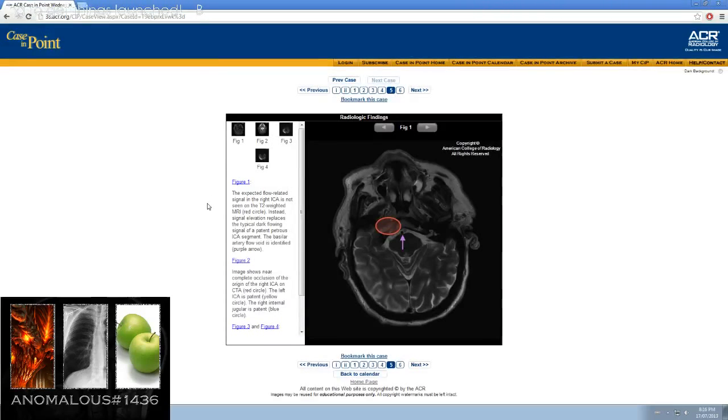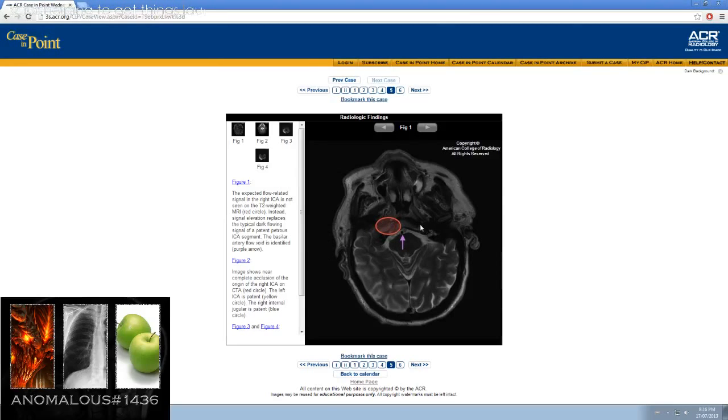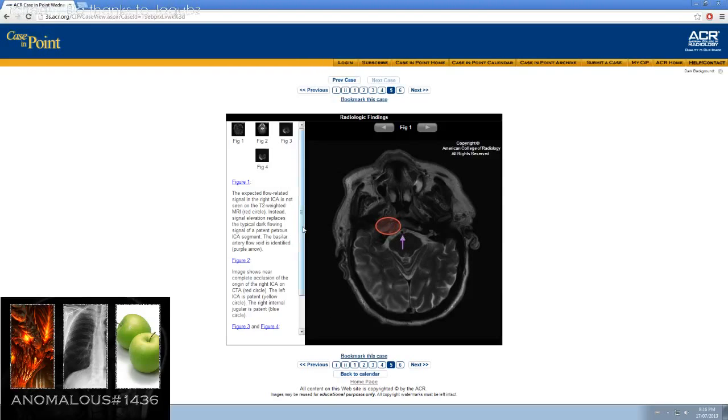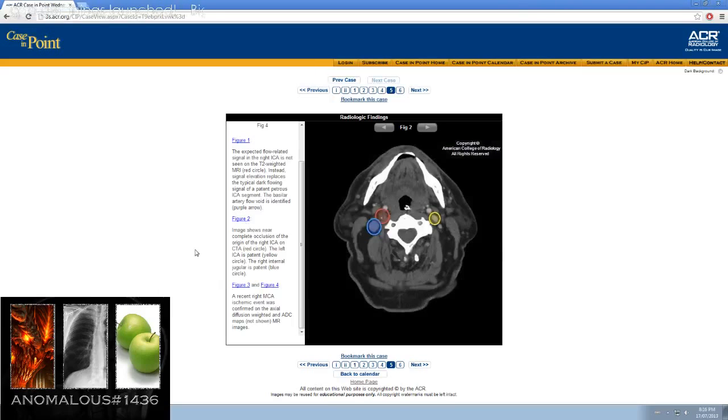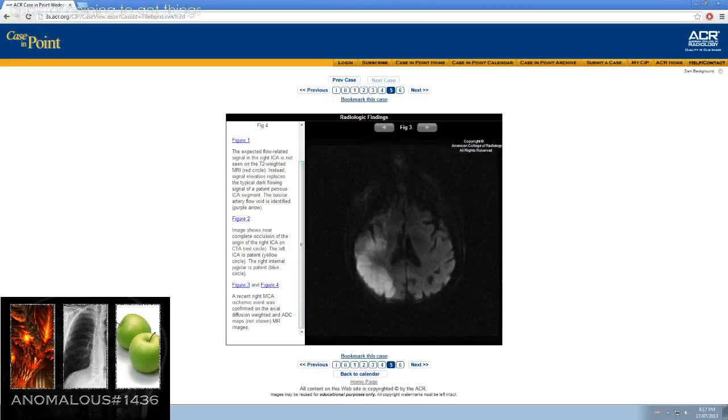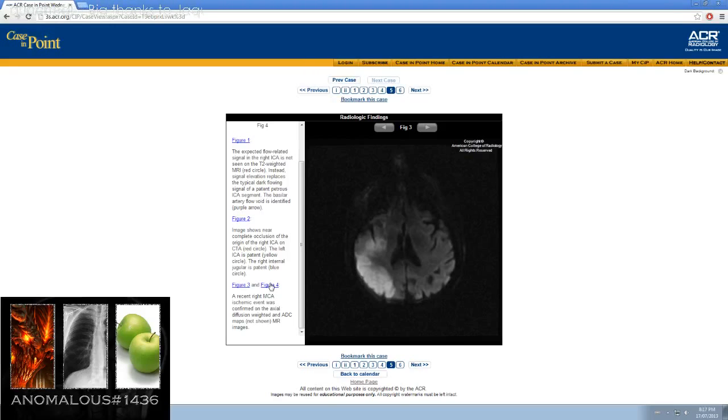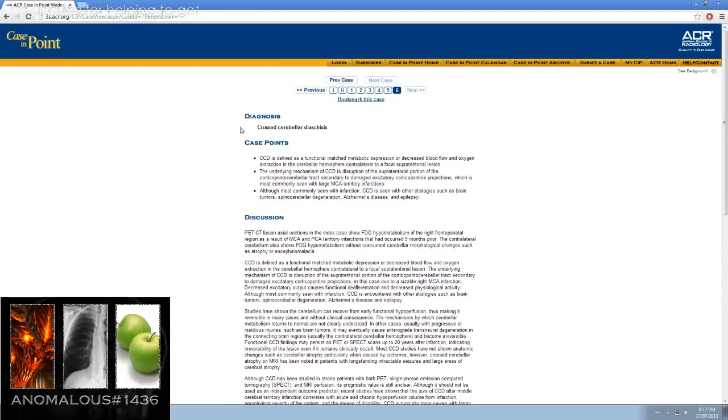Figure 1, the expected flow-related signal in the right ICA is not seen on T2-weighted MRI. So that should have been, it's tough to see now that circle, but it should have been black like the other side. Basilar artery blood flow is identified in purple. Again, black. Image 2 shows near-complete occlusion of the origin of the right ICA on CT angiogram, red arrow. The left ICA is patent, the yellow circle. The right internal jugular is patent, the blue circle. A recent right MCA ischemic event was confirmed on this axial diffusion-weighted and ADC map, which is not shown in our images.